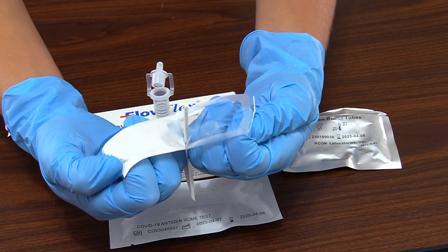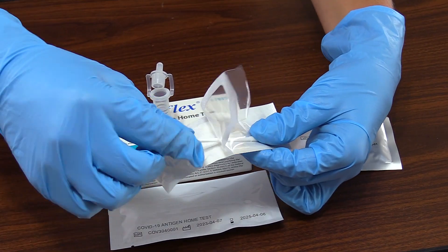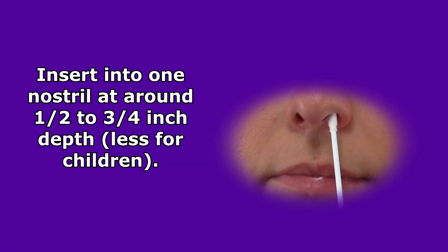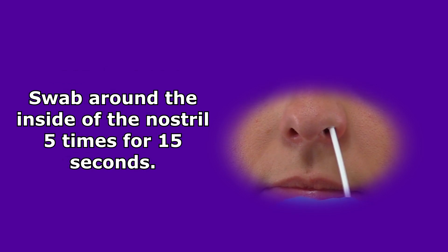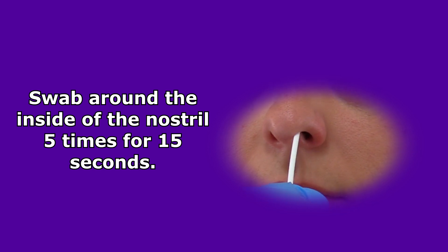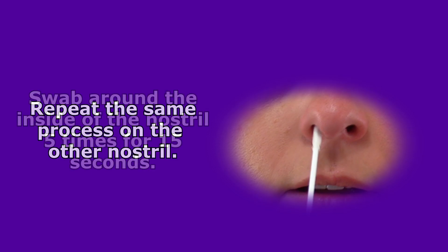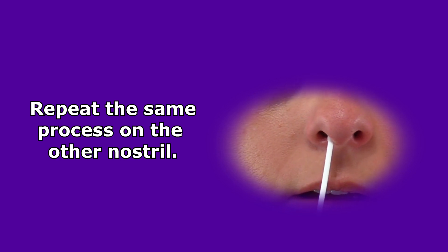Next, open up the nasal swab packaging at the stick end and remove the stick from the packaging. To collect the sample, insert the swab into one nostril about a half to three-fourths inch. Once inserted, swab the inside of the nostril wall in a circular motion about five times, and this should take around 15 seconds to do. When you're done with that nostril, go to the next nostril and repeat the same procedure.